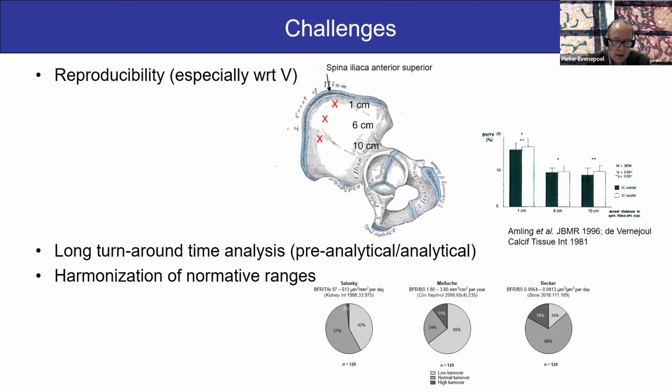The second challenge is that it's a time-consuming procedure. You have the labeling of the patient, which takes about 3 weeks. Then you have the assessment, which also takes several weeks. So in a world where we expect to have the results on the desk the next day, this is not happening with a bone biopsy.